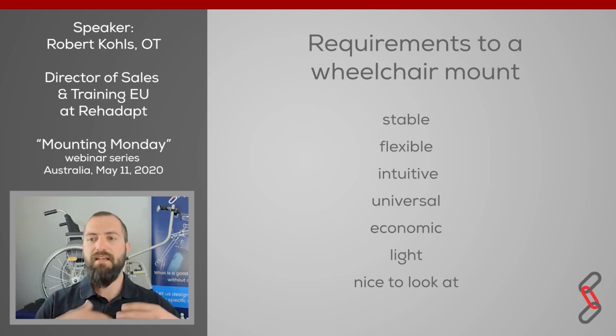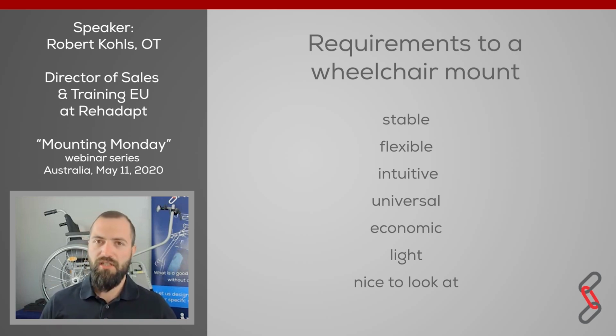You know as therapists that at the beginning, when you're working the first time with some mounting solutions, it might be a little bit challenging to understand what these quick shift levers are for, what these bolts are for, and the adjustability options must be extremely simple for the environment.